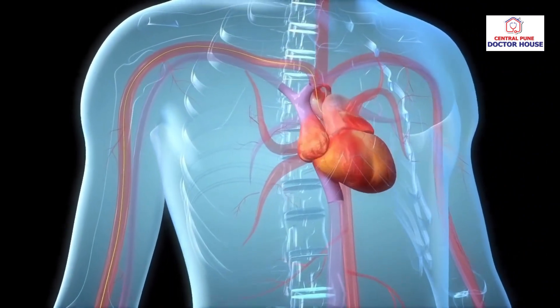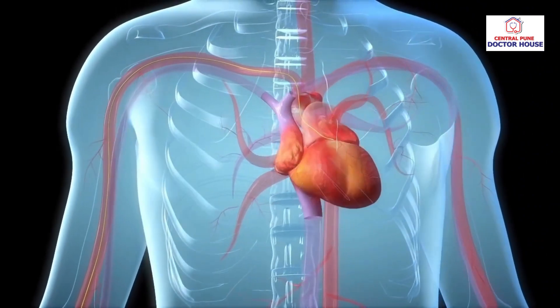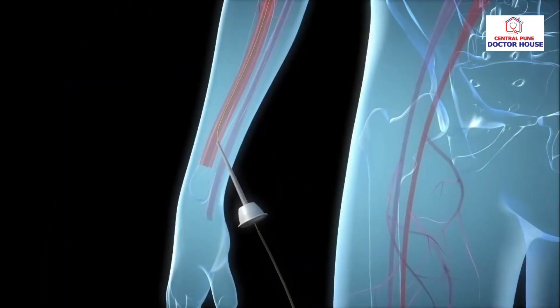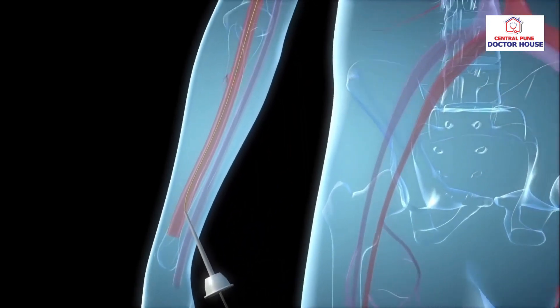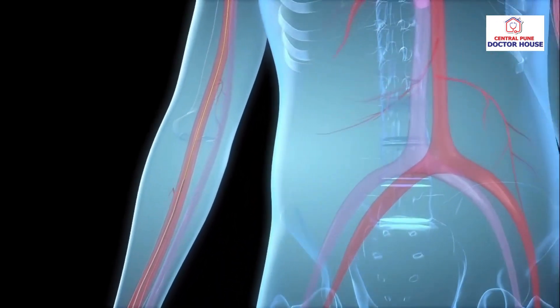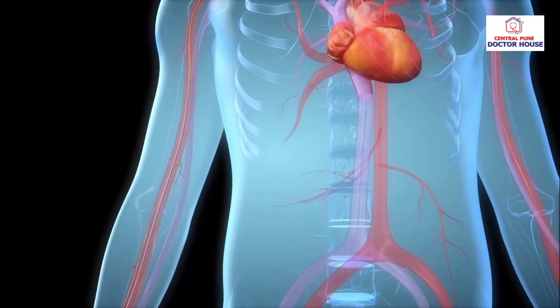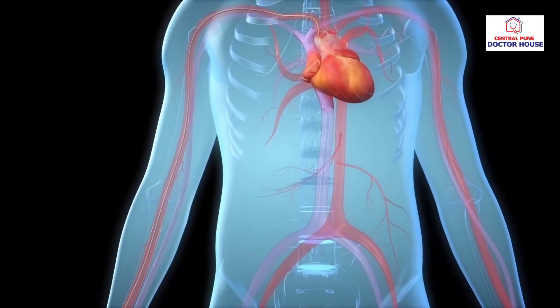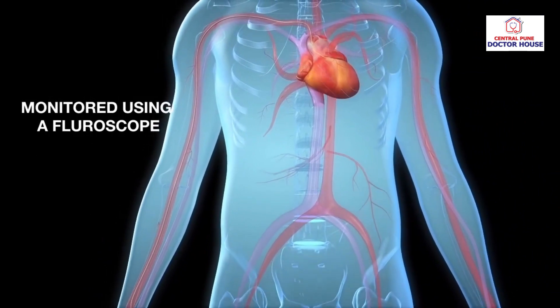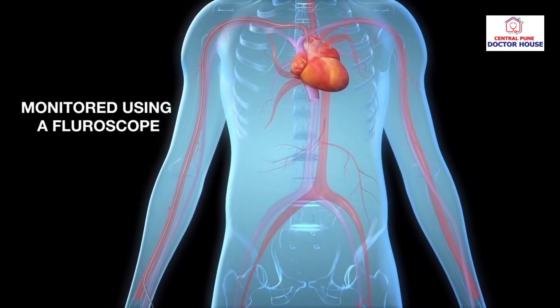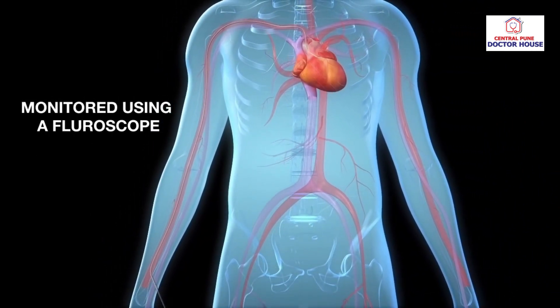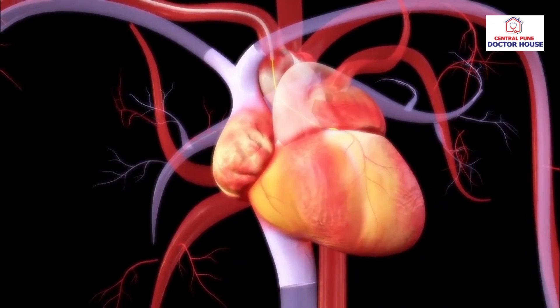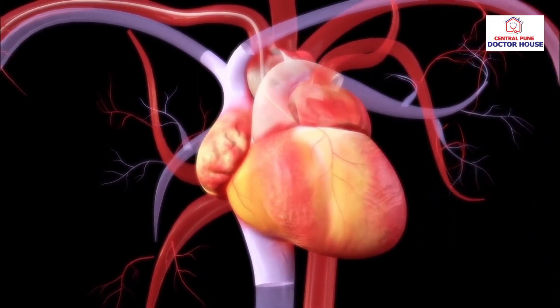The guide wire is guided through the arterial system up to the heart. A flexible catheter is slipped over the wire and threaded up to the heart. This process is monitored using a continuous X-ray imaging device called a fluoroscope.